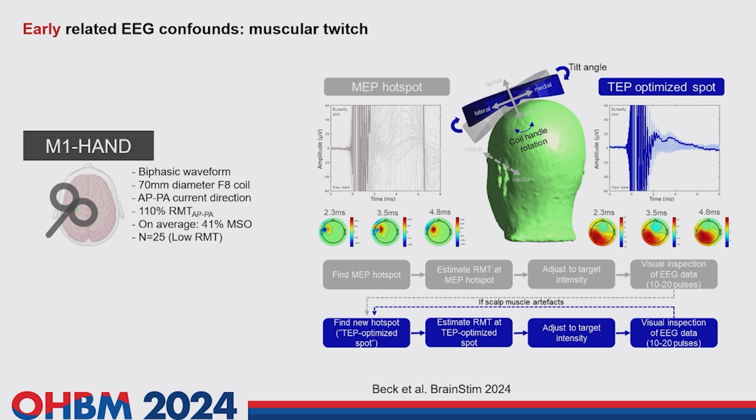We also usually have experiments, I have to mention that. We have experiments with subjects that have a lower motor threshold. This means that the intensity of the TMS pulse is lower. And lower intensity means that I am delivering less energy to the muscles or to the skull, and there is less probability to activate them.